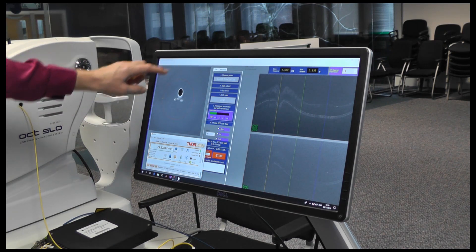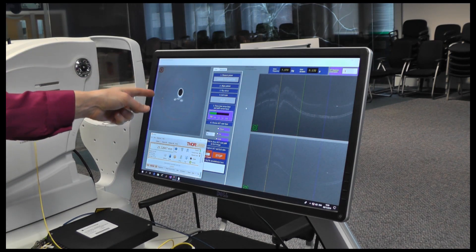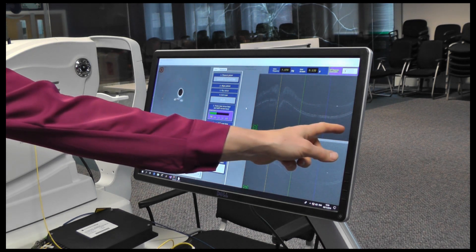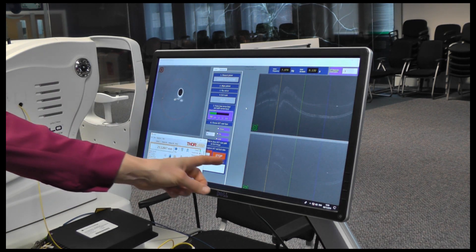That enables us to see the optic nerve and the blood supply, and then we can select an area, either a line or a circle, to take an OCT depth profile.